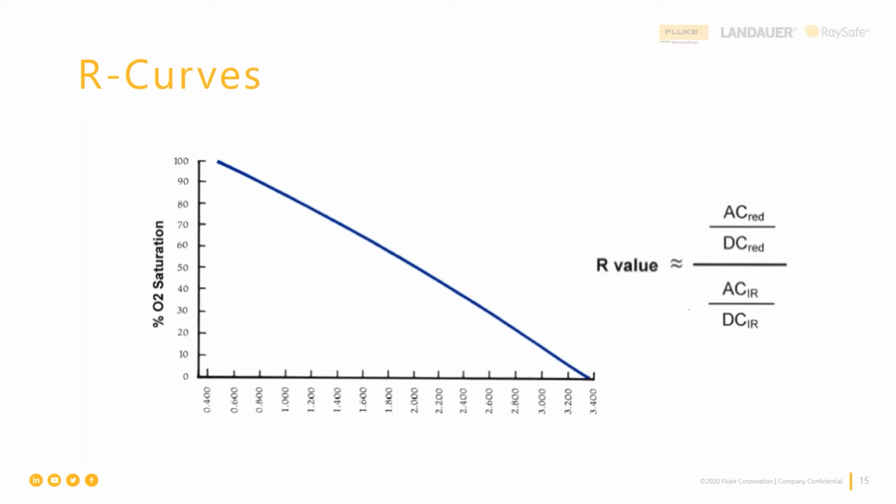What does that mean? That means when you're looking at pulse oximeters and trying to decide which one is the best one to use, or when you're trying to make the measurement of pulse oximetry to determine if it's functionally working properly or not, your test instrument must have a reliable R curve, which is brand and model specific. Each manufacturer of pulse oximeter, in every model that they make, has to determine this R curve. And as Mike has said, it is based on clinical studies, in particular, because you can see this curve goes from high to low. It is really a desaturation curve.